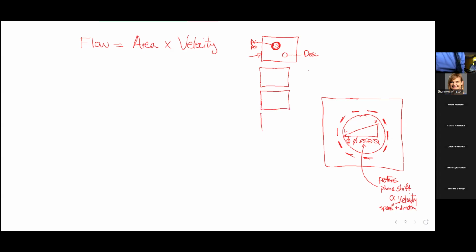And rather than just look at left ventricular volumes, now we're going to make a movie of this aorta, right? And the blood flow in the ascending, again, this is an axial view. And we're going to have the ascending aorta and the descending in all these pictures.